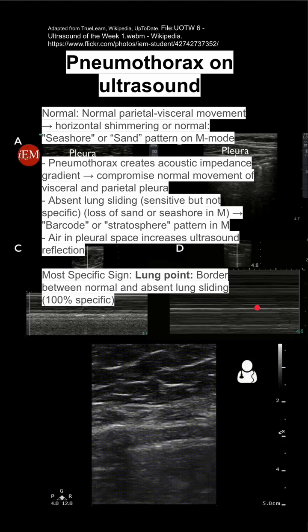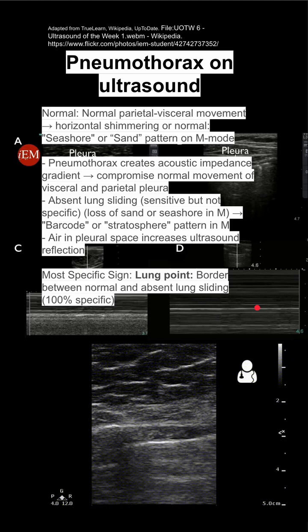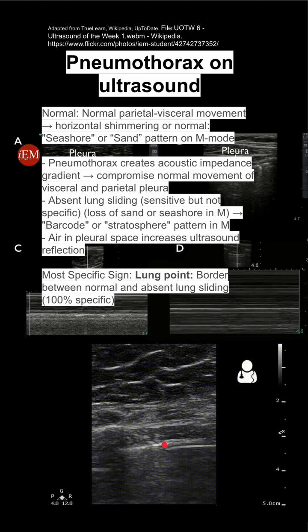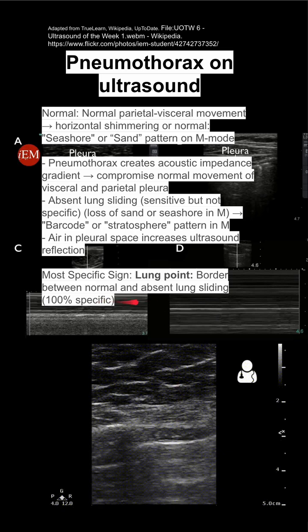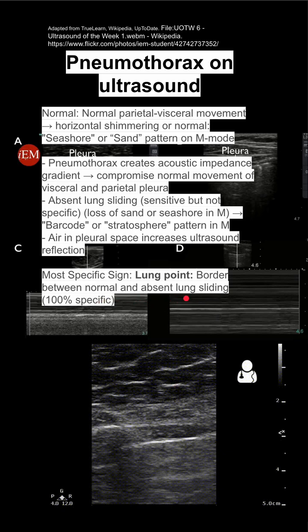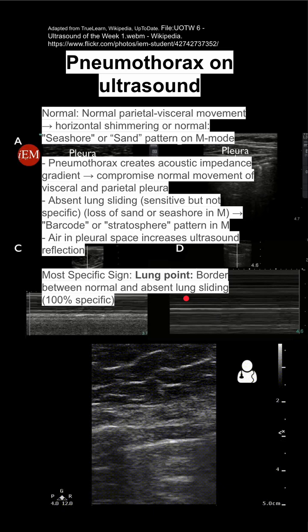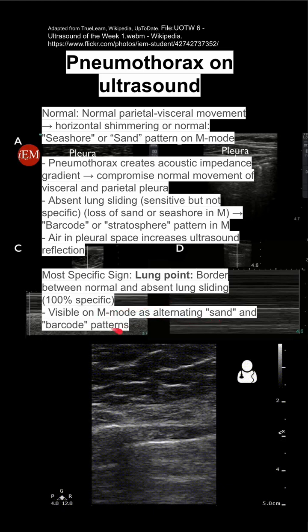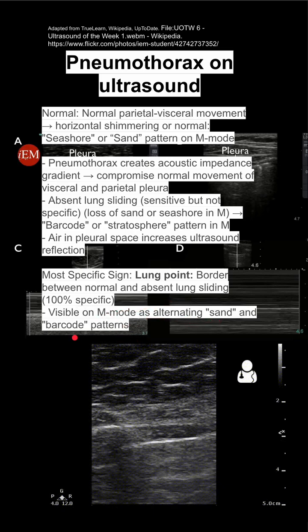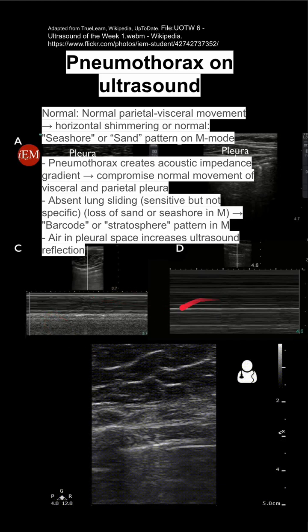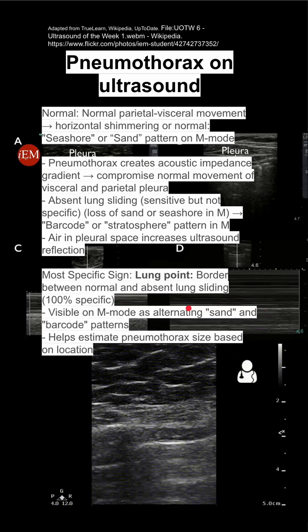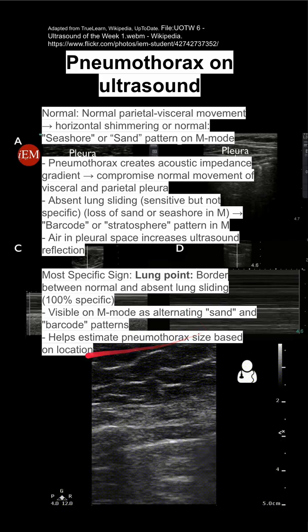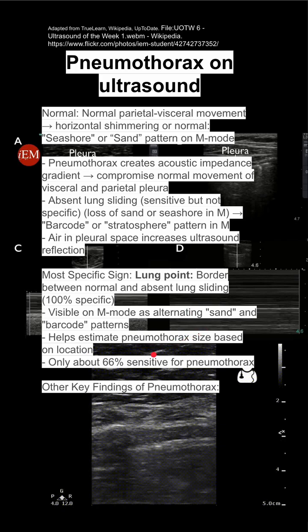The most specific sign for pneumothorax on ultrasound is a lung point, which is what I'm showing here coming in and out of frame. This is the border between the normal and the absent lung sliding, and some sources say this is 100% specific. It's also visible on M-mode as an alternating sand and barcode pattern — a mixture going back and forth. This helps estimate pneumothorax size based on location when you have an ultrasound.